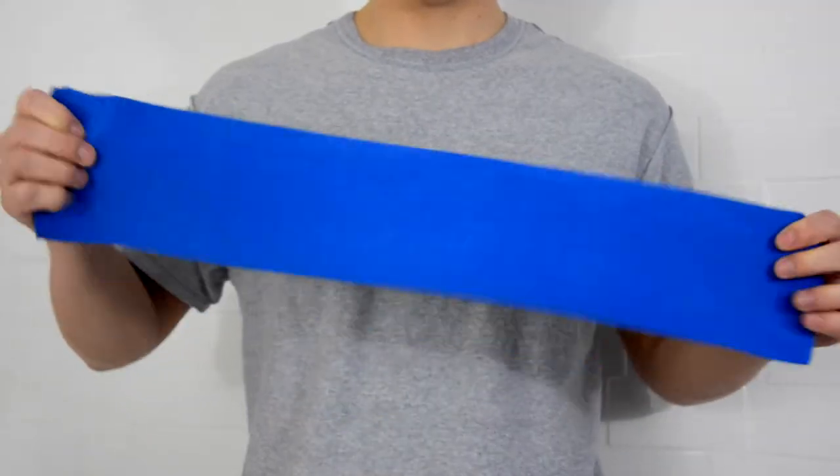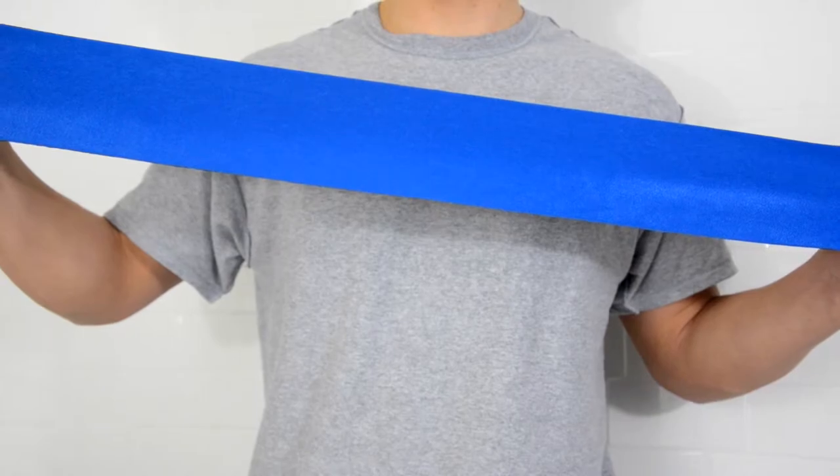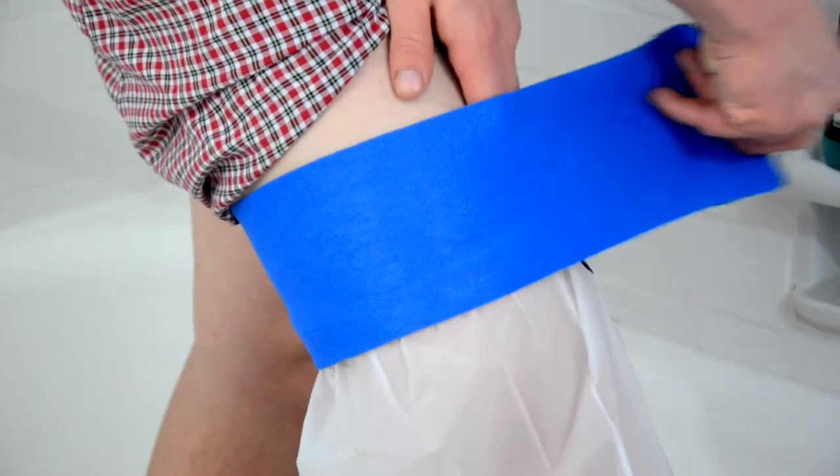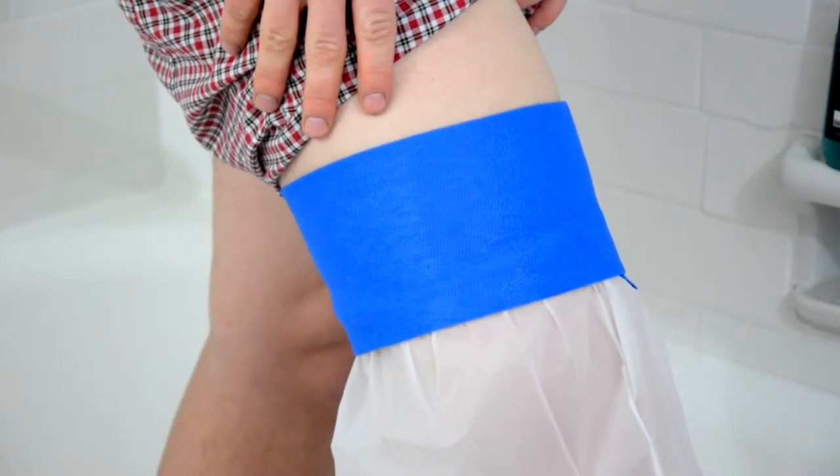The adjustable neoprene strap is comfortable and fits nearly any size arm or leg. Apply the strap by wrapping it firmly around the bag's elastic hem and securing the velcro grip to the blue fabric.